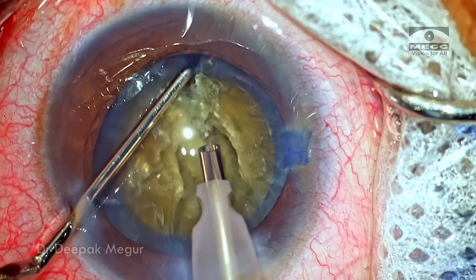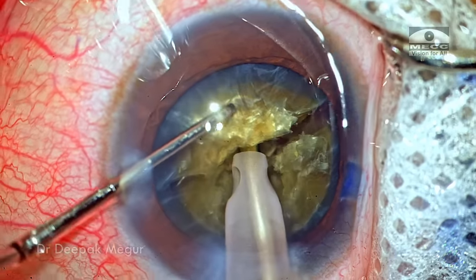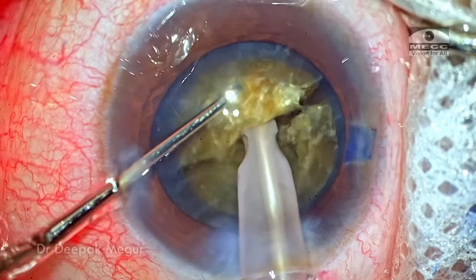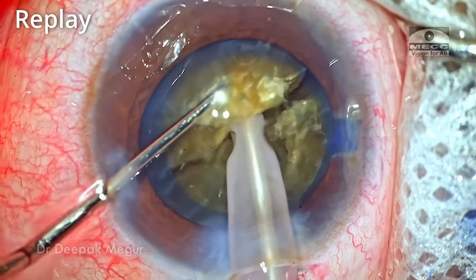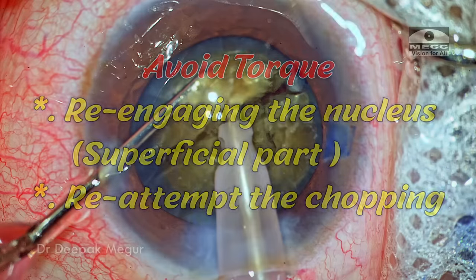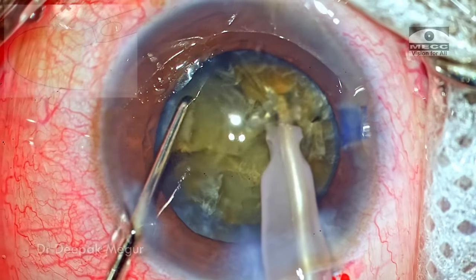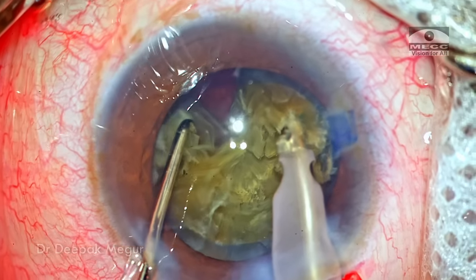I leave it there, rotate the nucleus, and try to bury the tip into the nucleus with the entire tip buried. But again when trying to chop the nucleus vertically we can see significant torque, which is not good. So I come out again, re-engage the nucleus in a more superficial part, and re-attempt the vertical chop. This time I'm successful in preventing the torque and the chopper goes down, then the lateral separation maneuvers are performed.